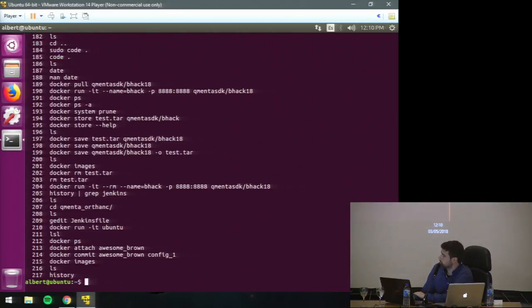This is going to show me the commands that I ran in the past. I can also move up and down to see the commands that I ran. I can kill a process with Control-C, detach from things with Control-D, clear the screen, and show the help. In general, for bash, the most important thing is to know how to show the help.